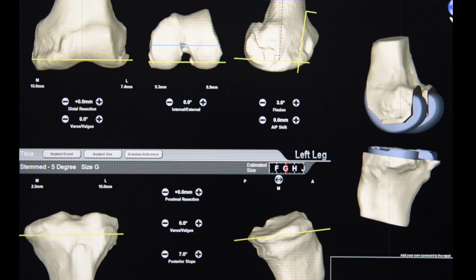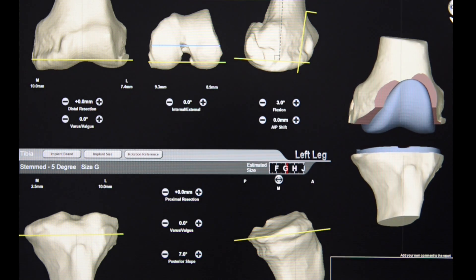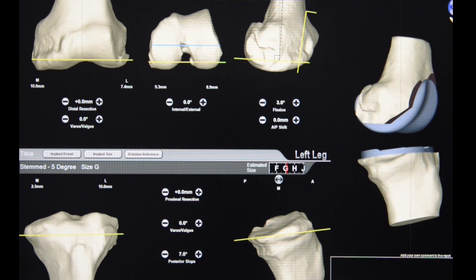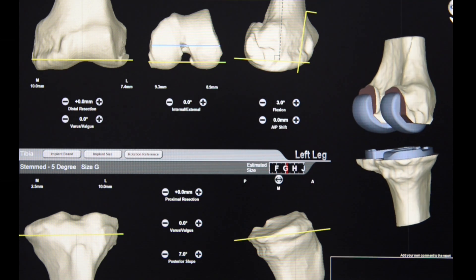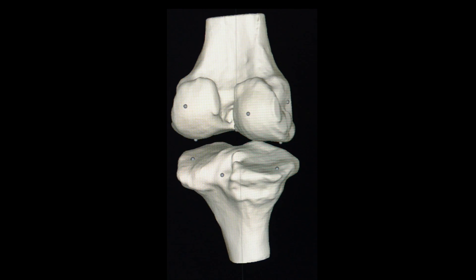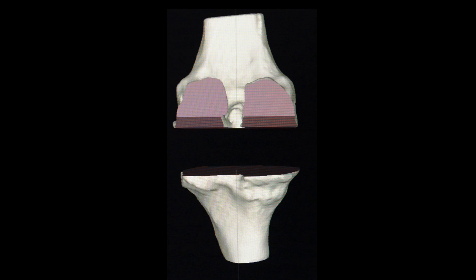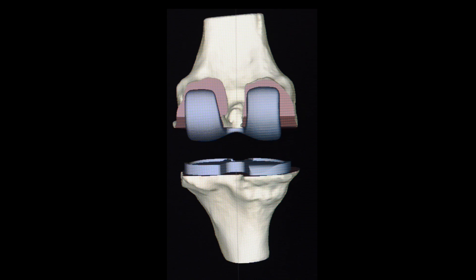From the images gained at the scan, a sophisticated computer program calculates a 3D image of your knee anatomy. Using these images, your surgeon will be able to plan your knee replacement and decide on the best size implants for your knee joint. Once we are absolutely happy with the plan for your new knee, we can order specific moulds that fit your knee exactly.